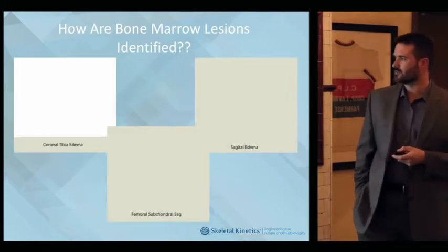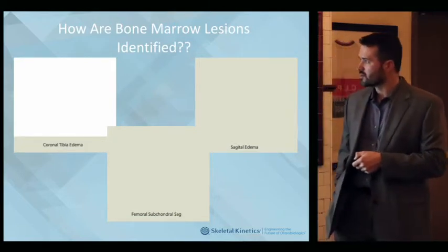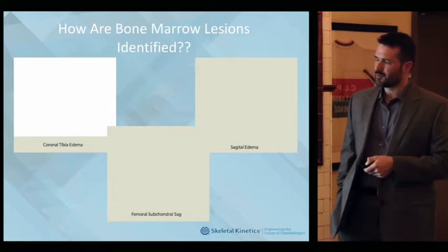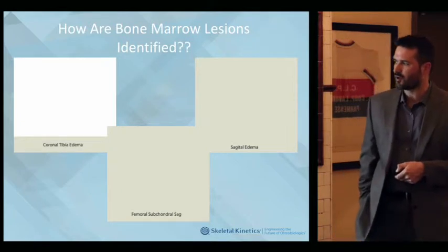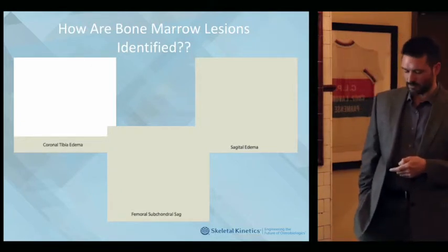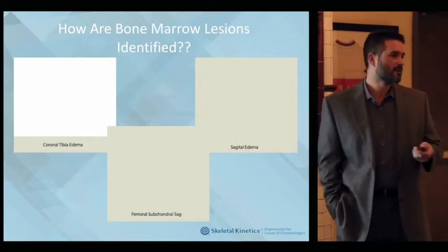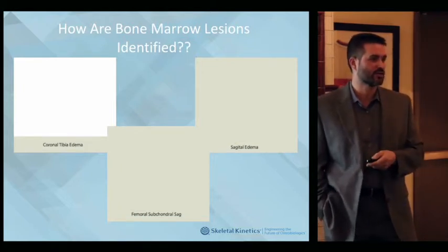So here's some visualization. You can see, I think it's here, yeah. So here's a little bit of the edema, tibial edema. And some of the radiologists will describe it as a subchondral fracture or edema. But depending on, and if you guys look at your own MRIs, they may call it edema, you may call it an insufficiency fracture.